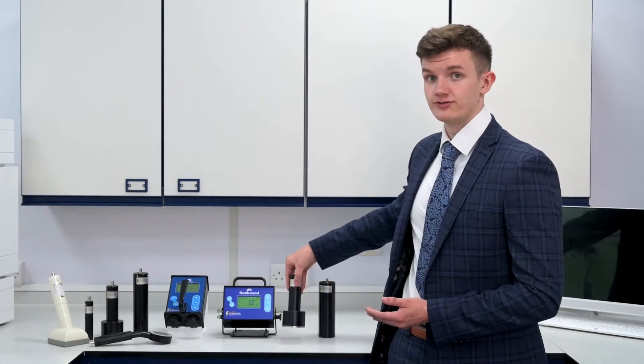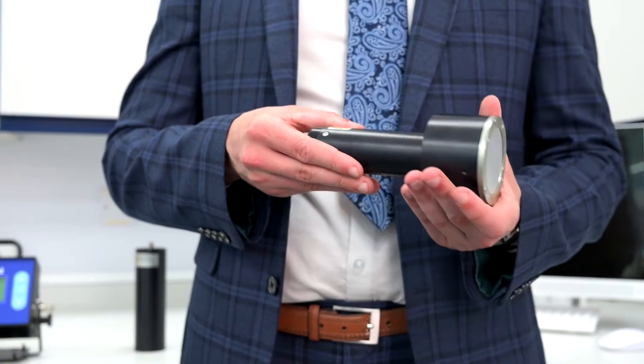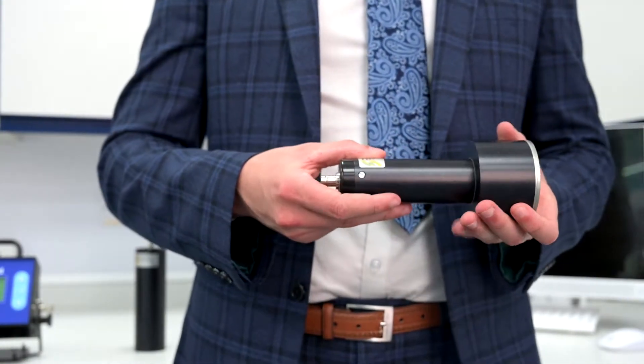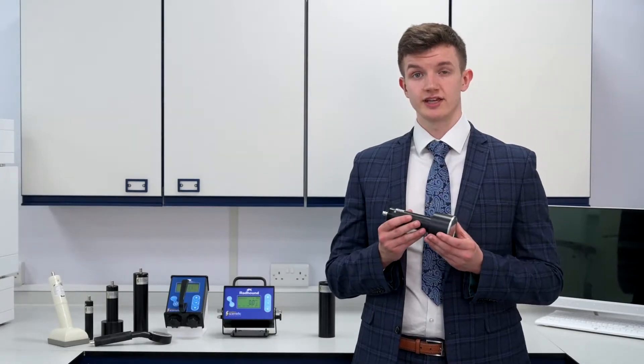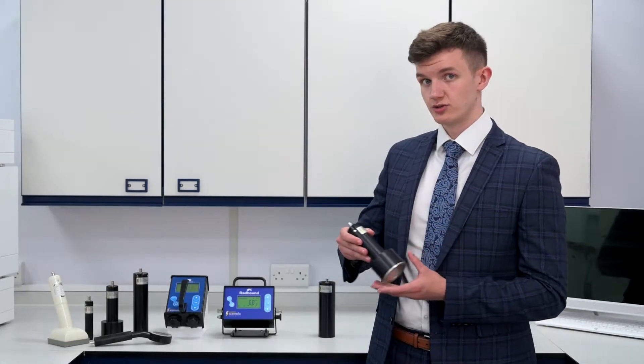The SS335. This probe is a general purpose end window compensated Geiger probe with H*(10) energy compensation. This is perfect if you prefer your measurements to be taken in dose rate.